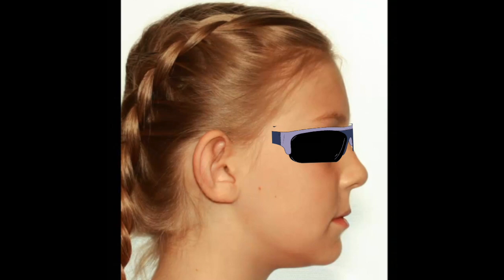Now, what can we guess about our maxilla based off what we're seeing here and why? What's the position AP of our maxilla and why? A little bit retrusive, retrognathic. And why do you say that?